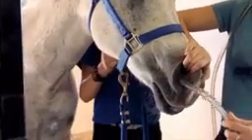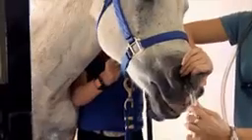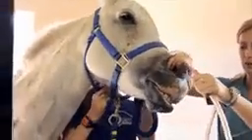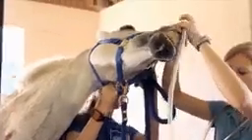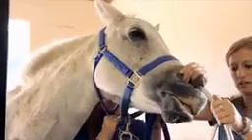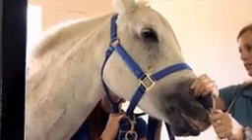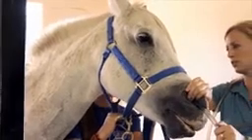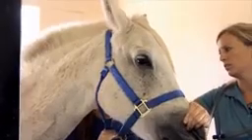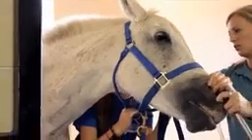So here I'm ready. Just going to slowly start passing the tube. And you can use your right hand here. I'm using my middle finger just to push the tube down. And as you're passing it, just always feel for any resistance, and you may need to redirect. So then I'm at her pharynx here, and you can feel, and you can also watch their throat there and watch for them to swallow. And once you feel the swallow, you pass the tube, and you can see it.